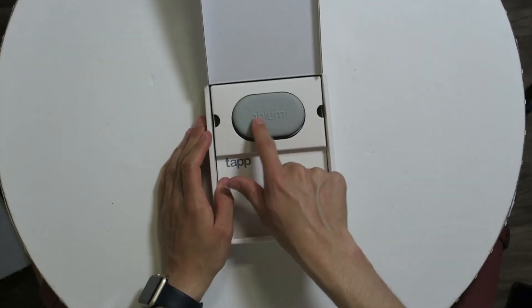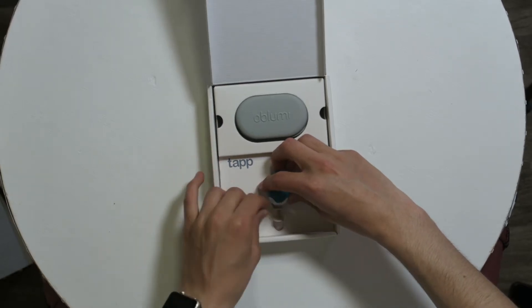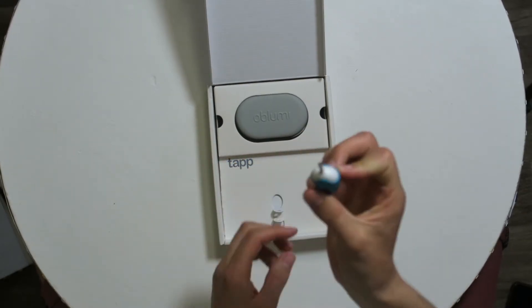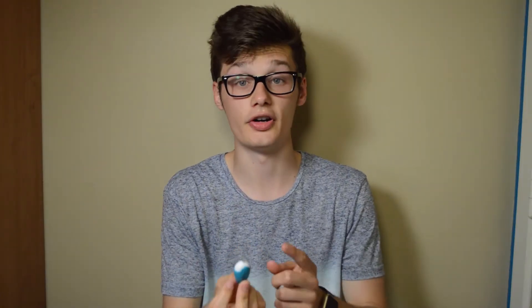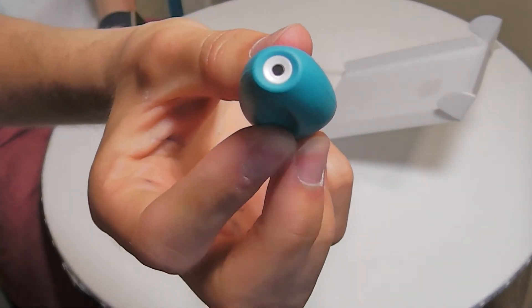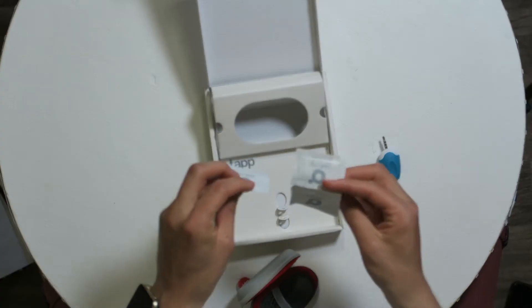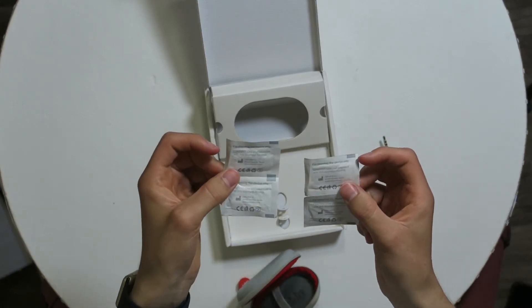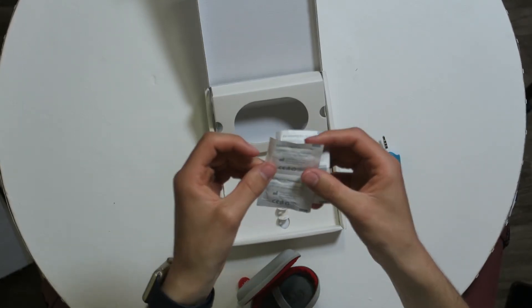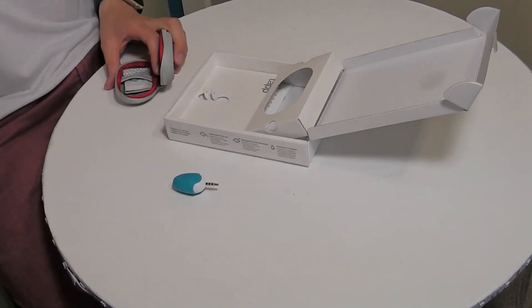The packaging looks very nice. We have a case — the Obloomy case — and the tap itself is connected via the auxiliary input, the headphone jack, to your iOS or Android device. This is the infrared thermometer with the infrared point, and this is the connection plug. We also have cleaning pads for the device, which is useful if you have more than one child and want to clean the device after it's been in someone's ear.